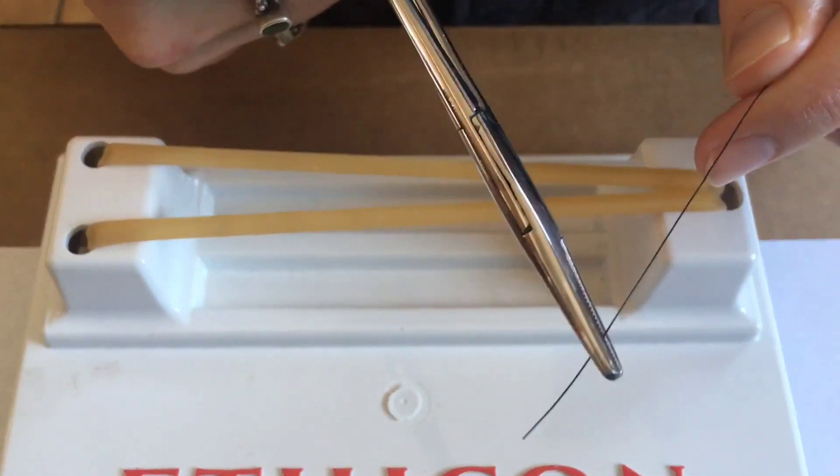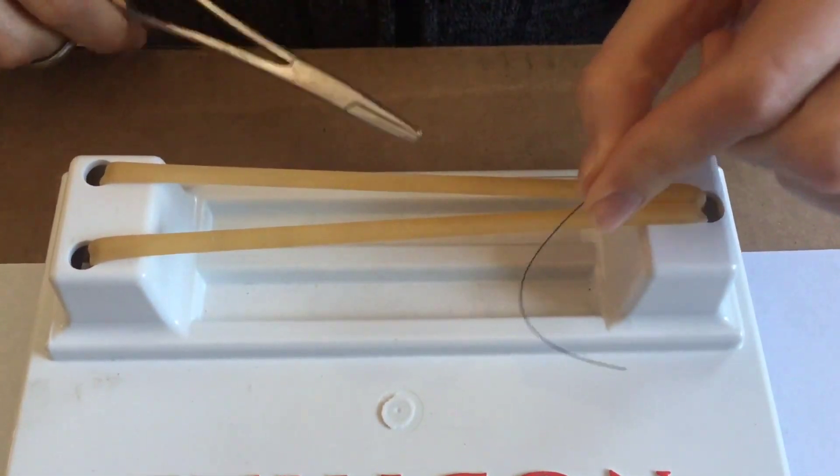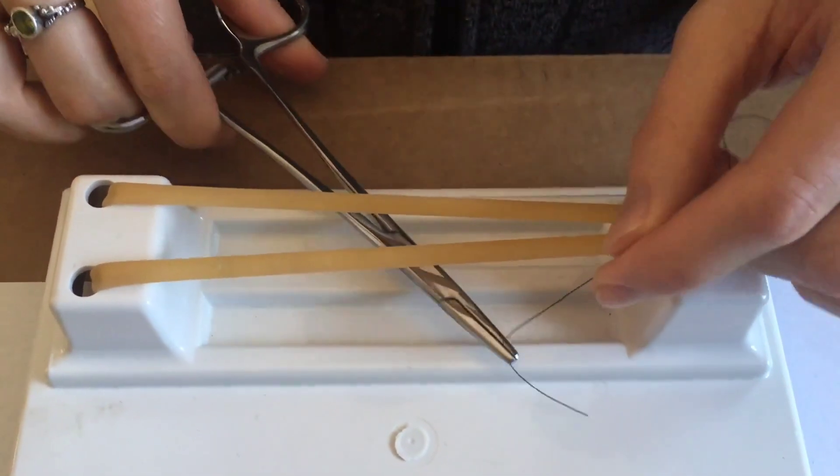Take your suture with the non-needle side and pass it over. Then put your needle drivers underneath and pull it through.